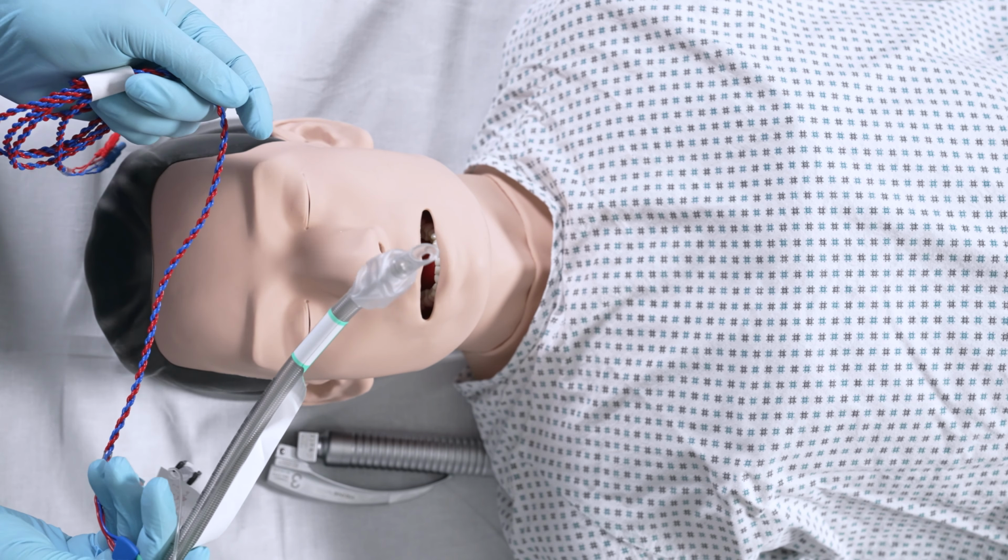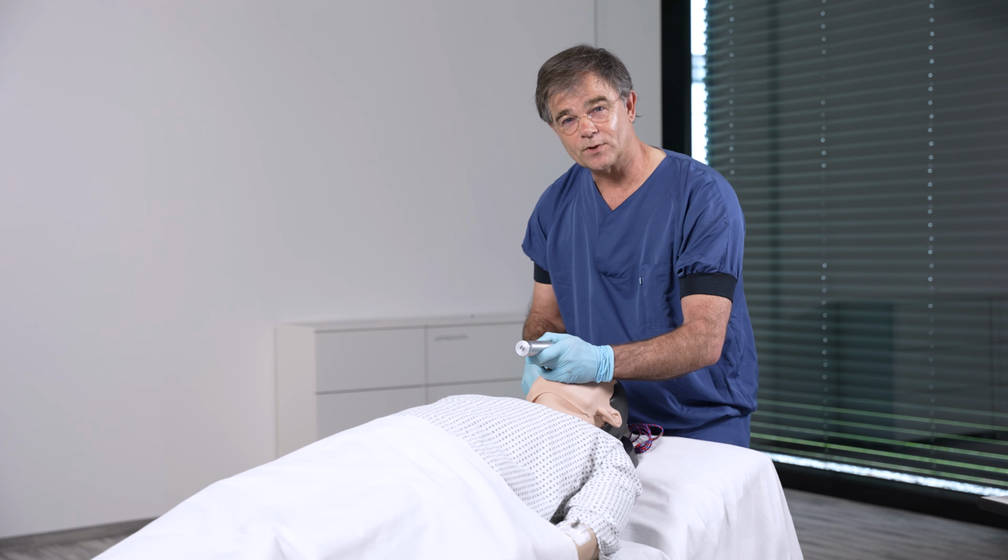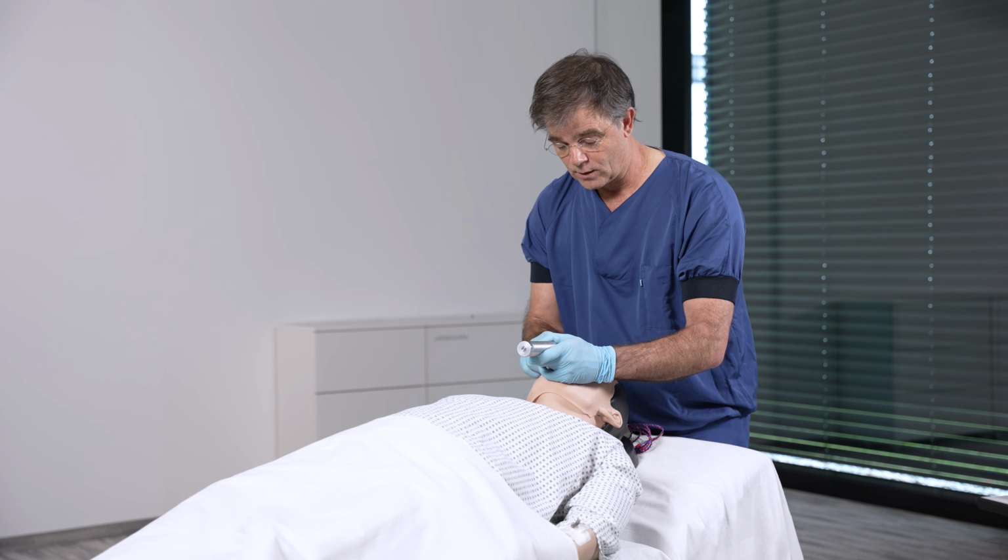I'll put in the laryngoscope. I'll try to obtain the best view, and now I have a Cormack-Lehane grade 2. And as you can see, placement of the NIM tube may be a bit awkward or difficult, and nobody can see what is going on in the larynx.